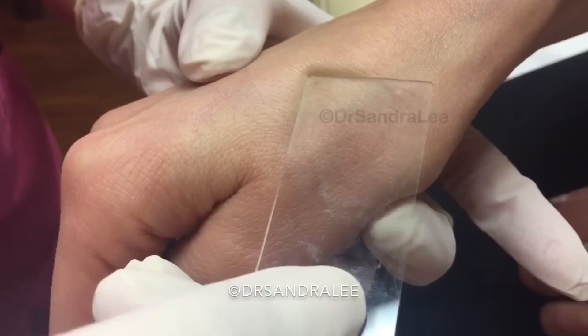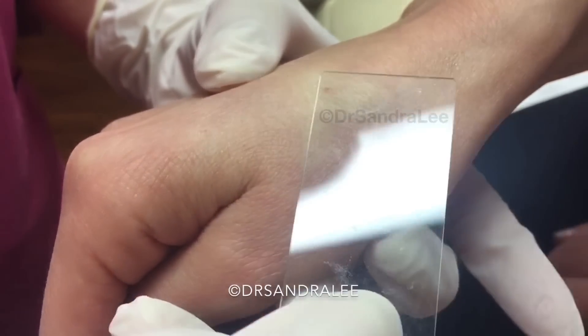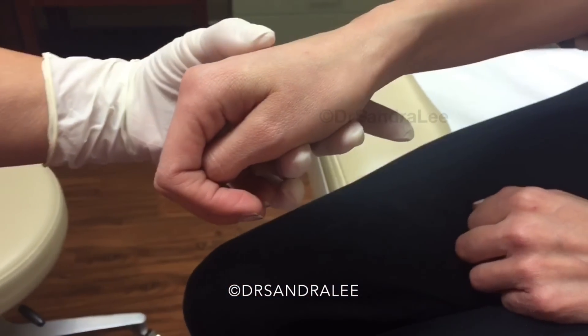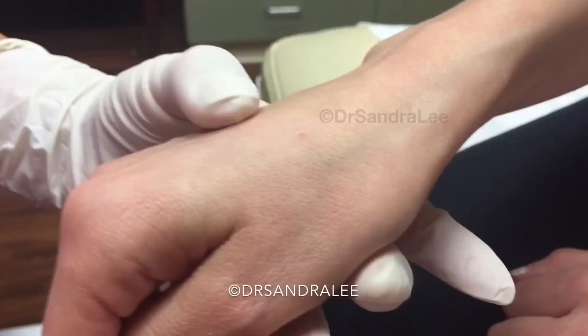A lot of times we think this is triggered by trauma — even something hitting your hand can cause a little blood vessel to burst there, a little localized one. In this case, we're going to use a little cautery. This is the cautery — it's just a little pinch.